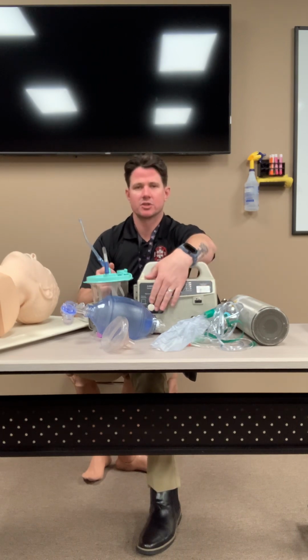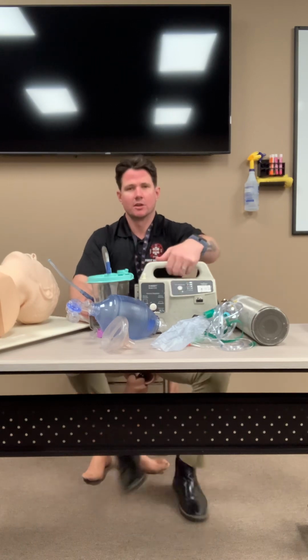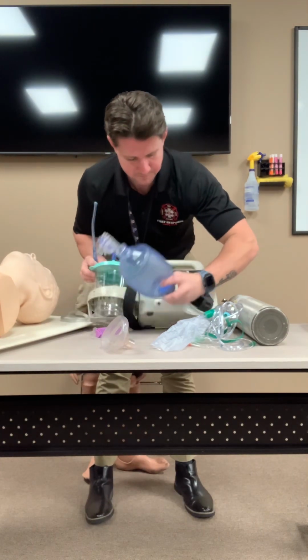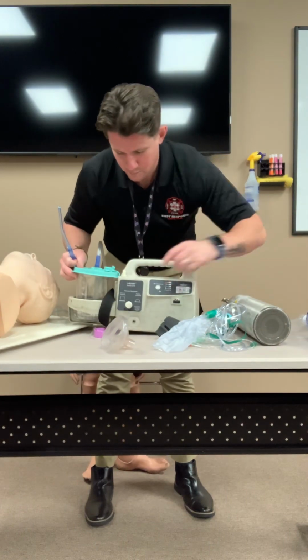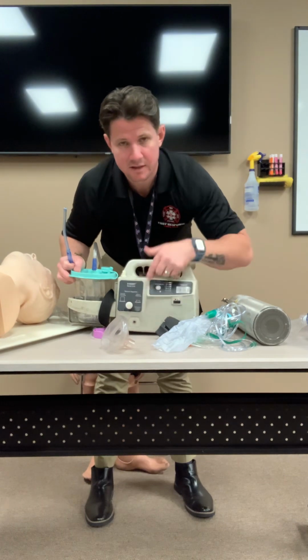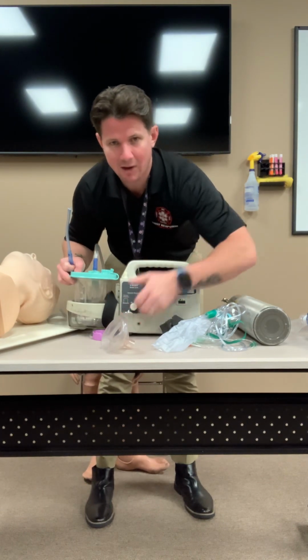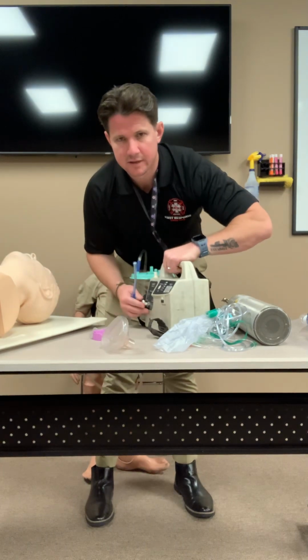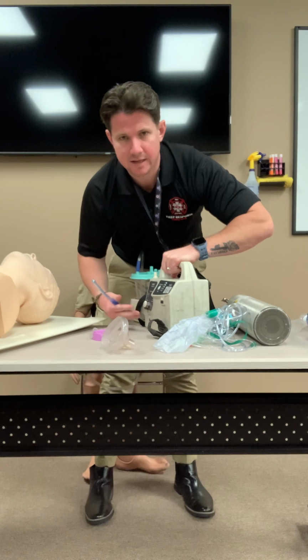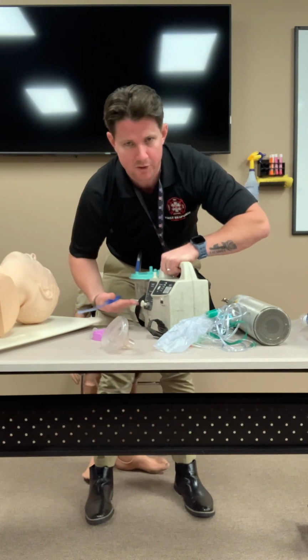Now I want to set my pressure. On this unit, there's only two pressures, a high pressure and a low pressure. And it states right here, when this button is pushed in, it's on its highest pressure. When you pull it out, that's out, that's in. When it's in, it's at its highest pressure. When it's out, it's at its lowest pressure, only about 120 millimeters of mercury worth of pressure.